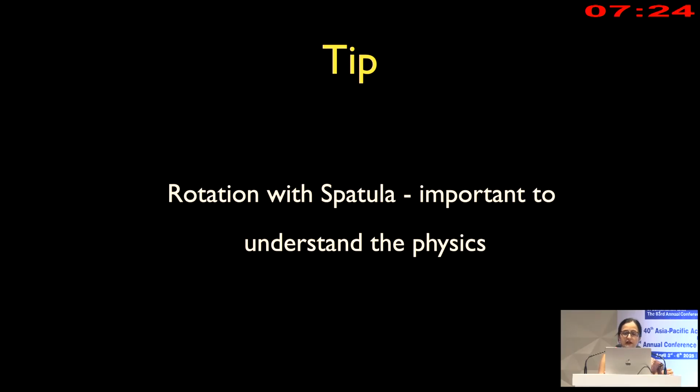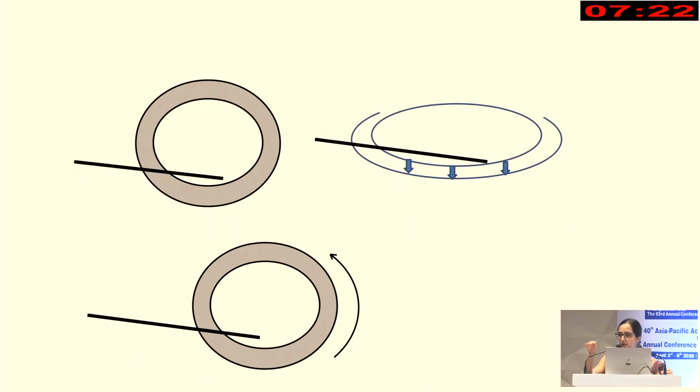But after a cortical cleaving hydrodissection, it is important to go down and then perform movements with your wrist rather than pushing down. The thing that was happening in the previous case was pushing down too much, which was causing a stress on the zonular complex and caused that dialysis eventually. As you can see in this animation, this hand figure here, try to make it a swiping motion.